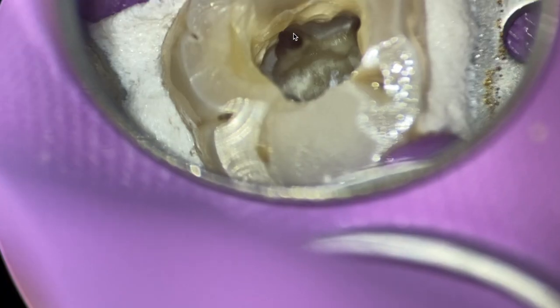I don't worry about tugback. I just want to make sure I've got an apical stop so that gutta percha point does not keep sailing out the end. That's why I used to try in points with irrigant, but now I just try in points because it's part of the efficiency and the flow. I don't dry my canals just like here, and then I fit my gutta percha and I'm like, oh damn it, I have to, my gutta percha is not going all the way down. So MB2, you can see that. I think where I was aiming for normally was going over here, going horizontal, but actually kind of overshot, I think, in prepping that canal.